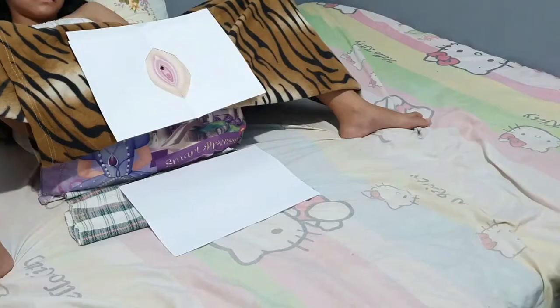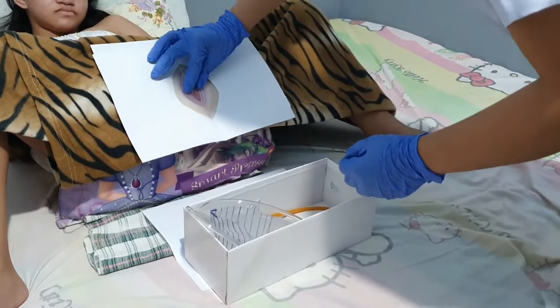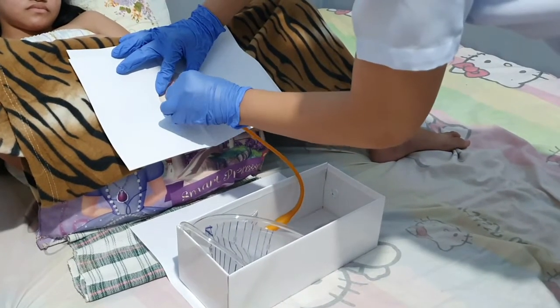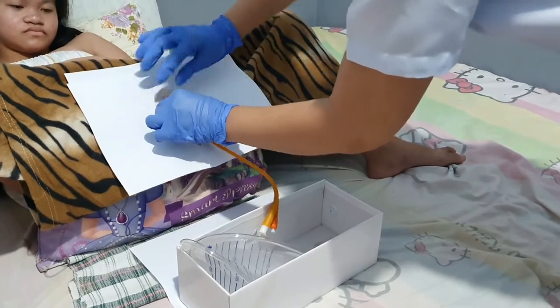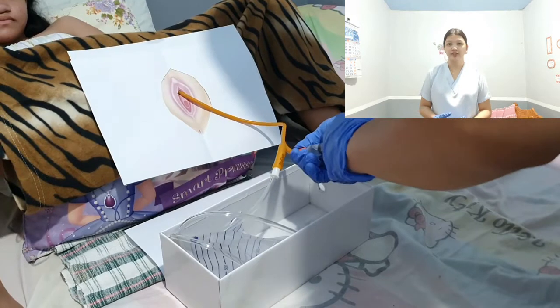Next, I am going to place the sterile tray between the legs of my patient, and I am going to use my non-dominant hand to spread the labia and my dominant hand to grab the catheter. Then make sure that the catheter is lubricated before inserting it. Insert the catheter slowly and gently until urine flows from the catheter. Next, I am going to slowly inflate the balloon after inserting it.